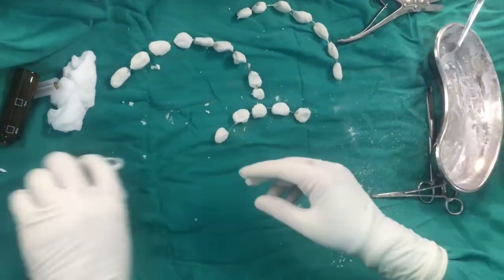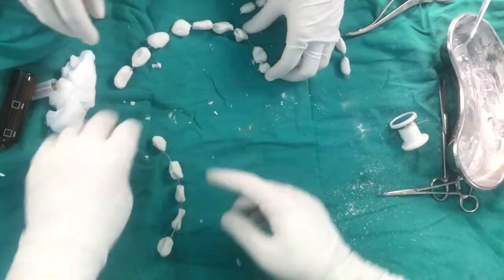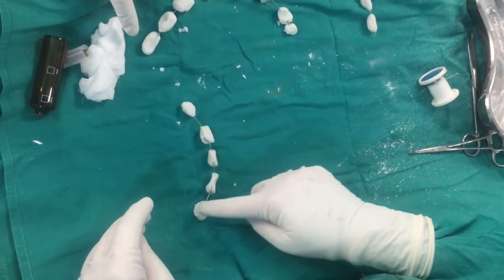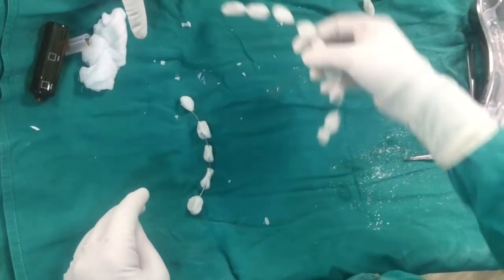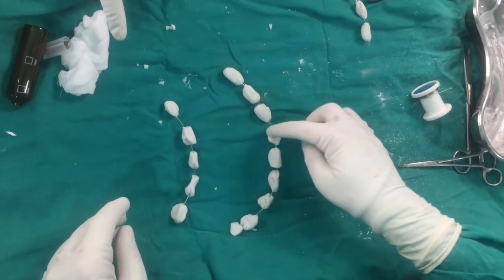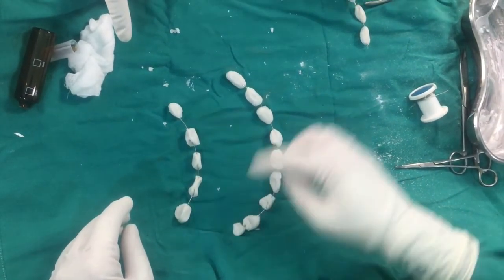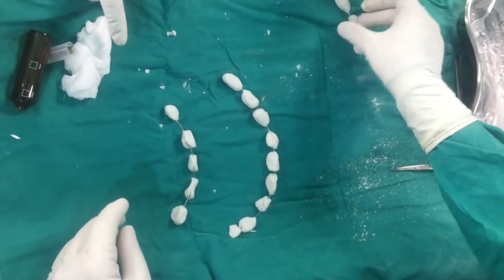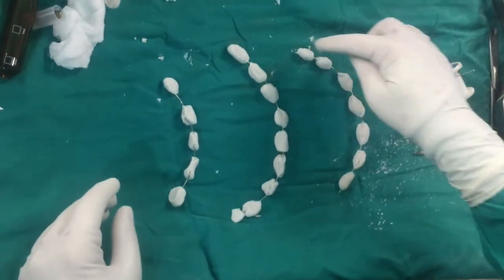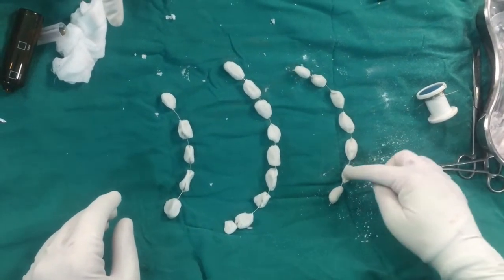One more important step with these antibiotic beads is counting the beads. We should count each and every bead so that when we remove the antibiotic beads, we do not leave any beads inside the wound. This is a simple and effective way to make antibiotic beads without any templates.